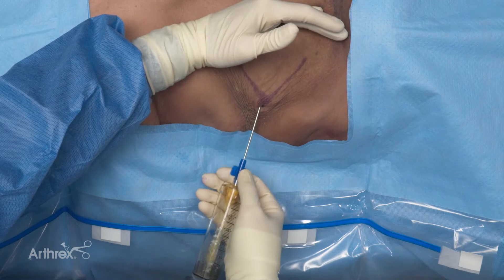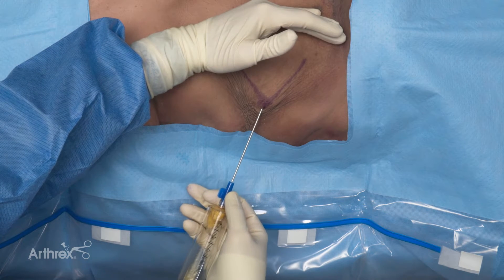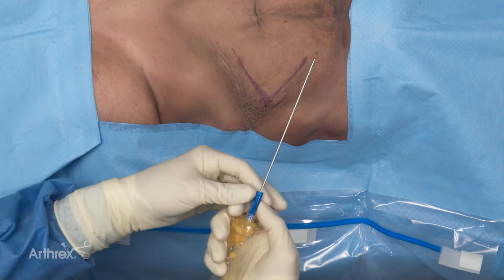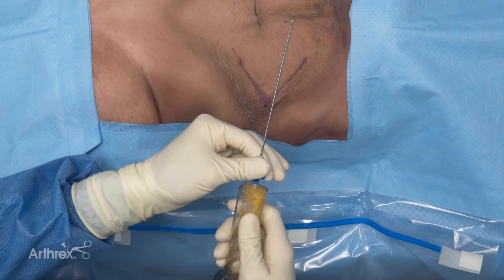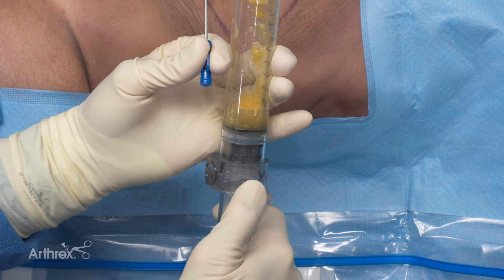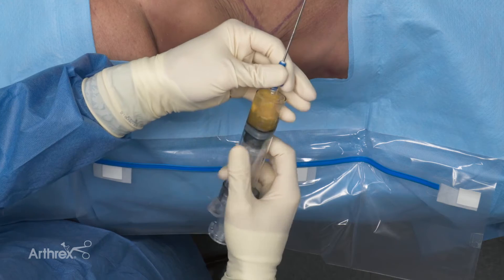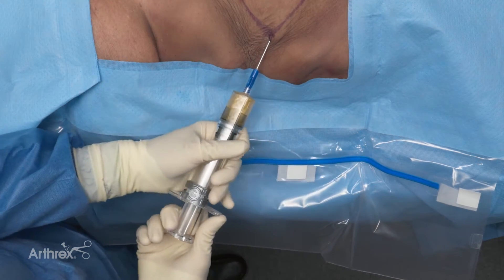A common occurrence is that you'll lose vacuum suction, which can happen because you retract too far. So you heard that kissing noise — if that happens, all you need to do is retract the entire device back out, keeping good sterile technique the whole time. Remove the cannula, unlock the device, push the plunger forward — that's going to remove the excess air. Be careful not to go too fast so you don't get any splatter. Reattach the cannula, reinsert the device, and recreate your vacuum.